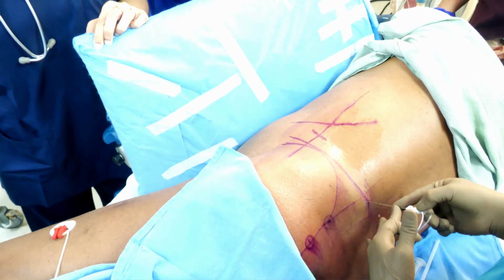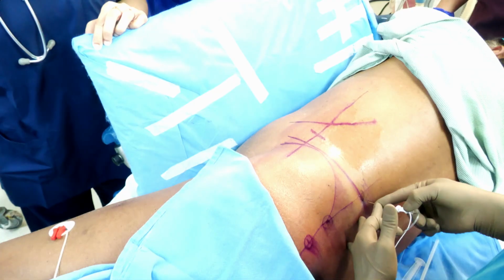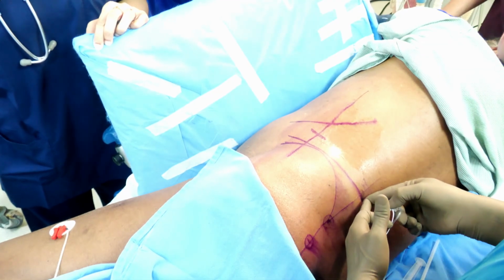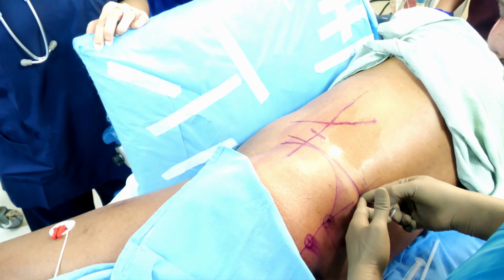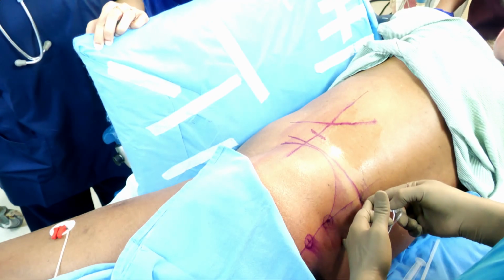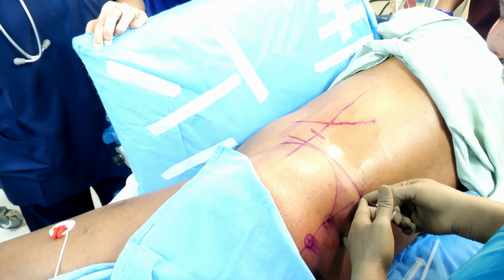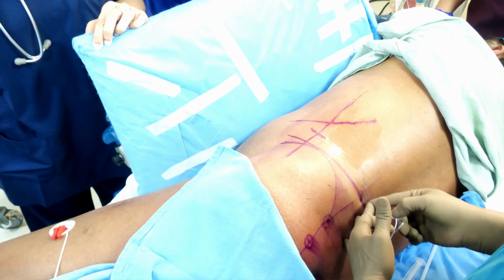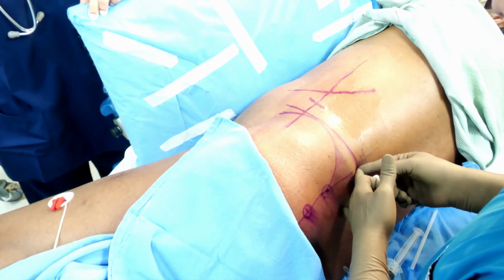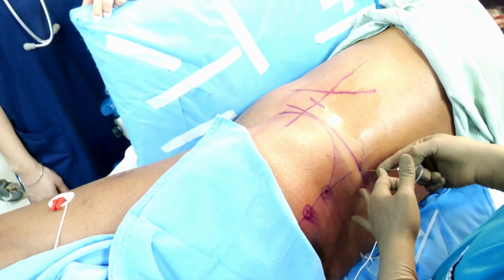So I'm unable to hit the transverse process. Going a bit more medial. I could hit the transverse process. So I'm keeping my needle just around 1.5 centimeters beyond that and not going still more caudal, medial. So this will be a caudal and medial again.